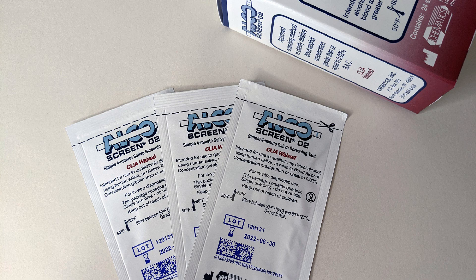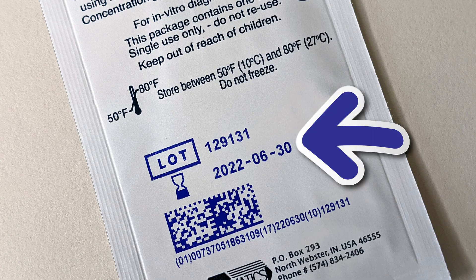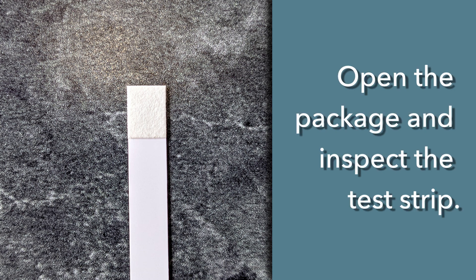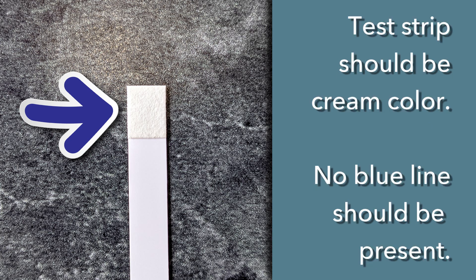To conduct a test, allow the donor to select an unopened package. It is a best practice to show the donor the expiration date on the front of the package. Do not use an expired test. Next, open the package in the presence of the donor and inspect the test strip to ensure the test strip is a cream color and that no blue line is present.